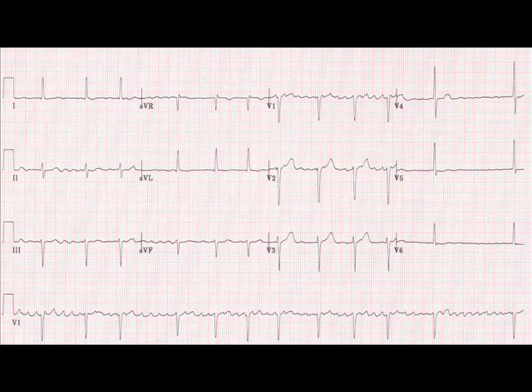Firstly, atrial fibrillation by nature, if untreated, is a fast rhythm — it's a tachycardia. What's happening is there is ongoing chaotic, disorganised electrical activity within the atria. They're fibrillating. And you can see this on the 12-lead: instead of a flat line and a clear round P wave between normal QRS complexes, you can see this fibrillating, raggedy, undulating baseline.